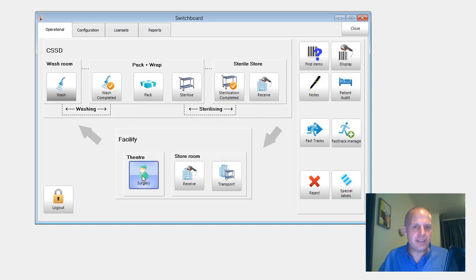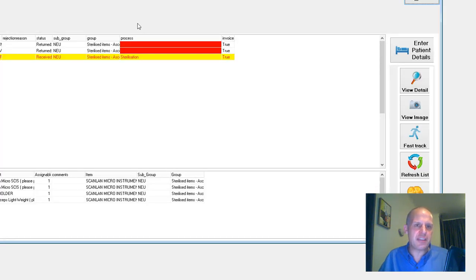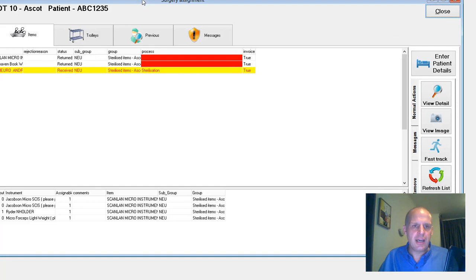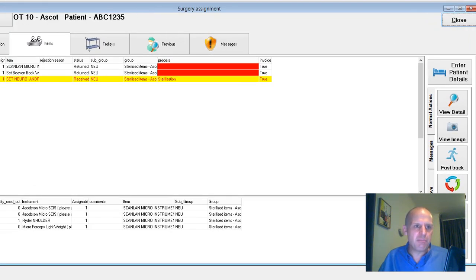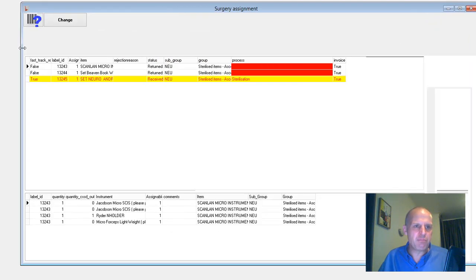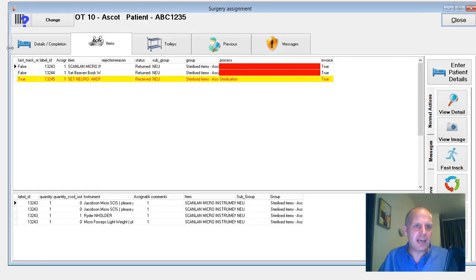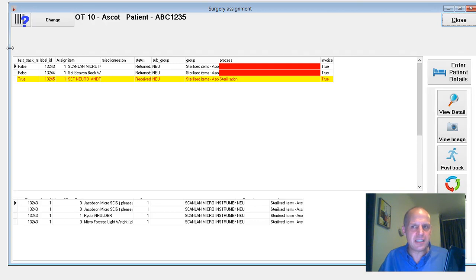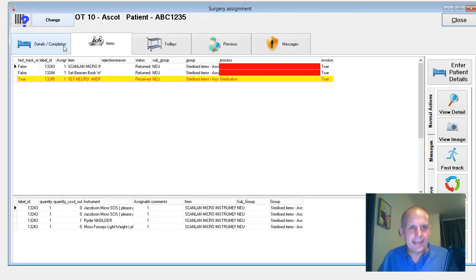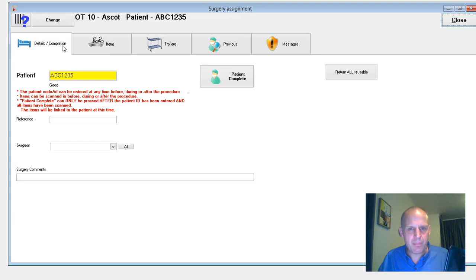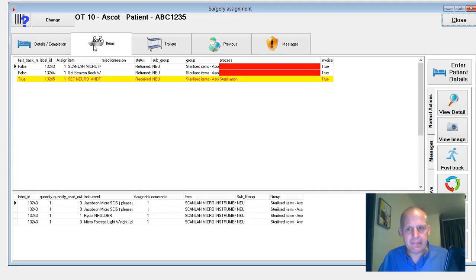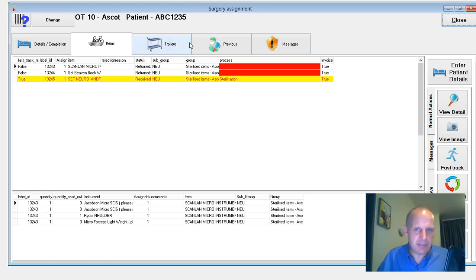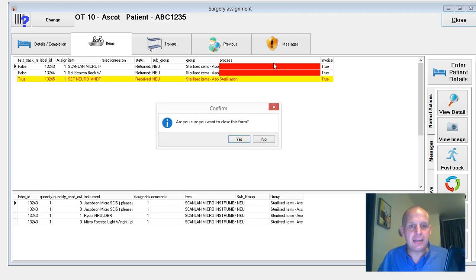And then last but not least, the surgery screen hasn't changed that much. The main reason why I'm resisting always changing the theater screens is because we're trying to leave that as consistent as possible. And the changes that have happened are behind the scenes, so you're not going to see them anyway.